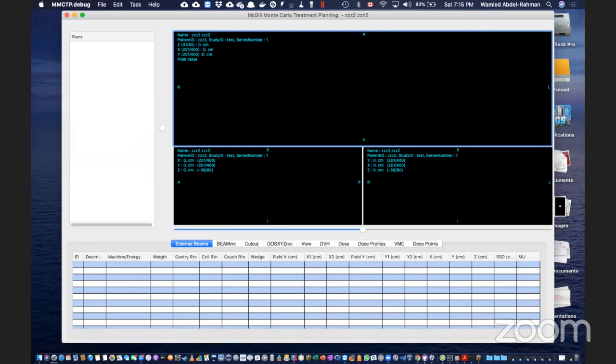So I probably need 80 calculation boxes to do a calculation for the full pattern. But then the resolution is not as good. So that's it. This is the phantom.